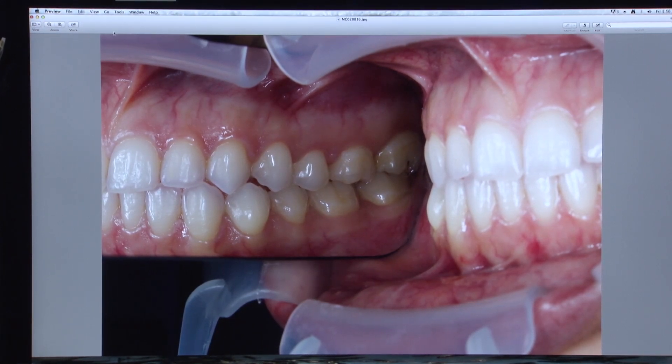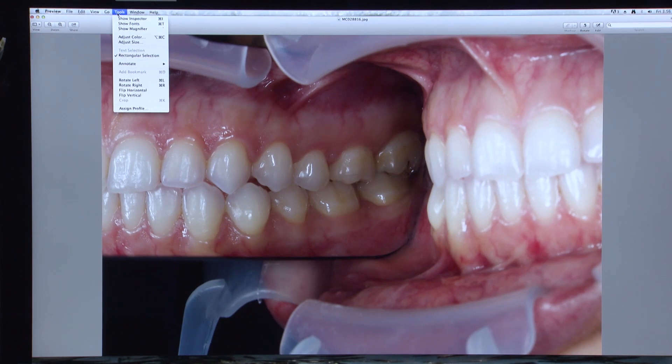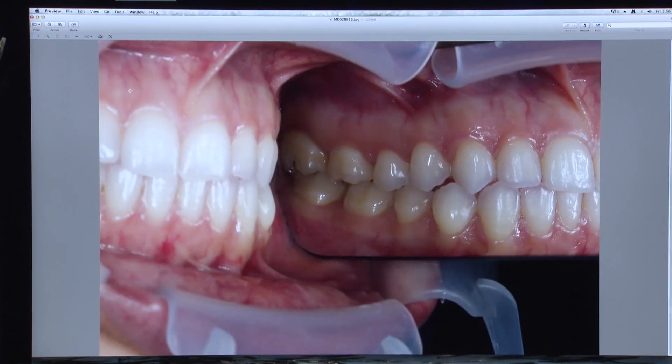Keep in mind that a reflected photo is exactly that — a mirror image of the original capture. My office computer happens to be a Mac, but simple photo editing can be performed on a PC with the paint program or other editing options. I attempt to flip the image either horizontal or vertical in order to show what would appear to be a straight-on image of the tooth and how it appears in the mouth.